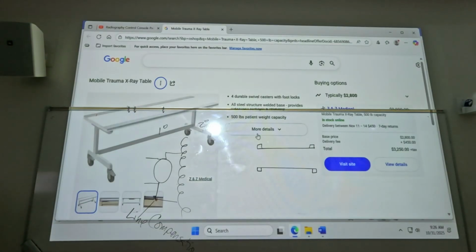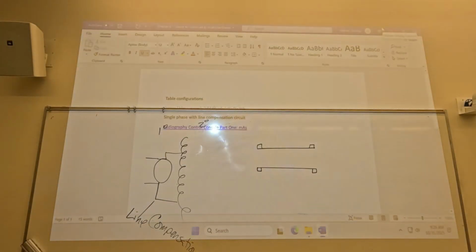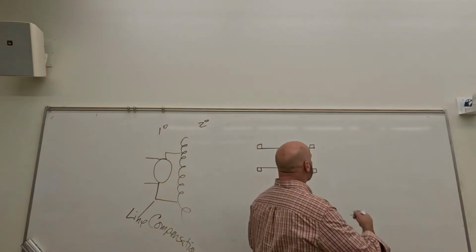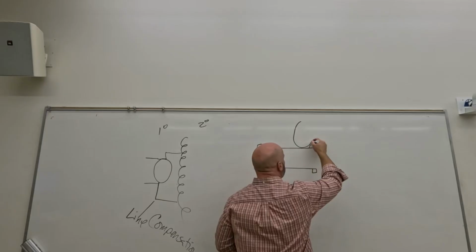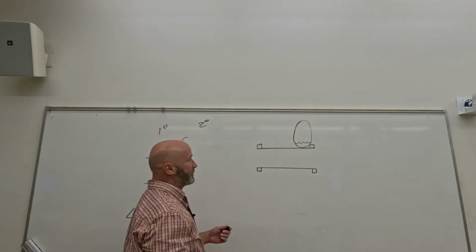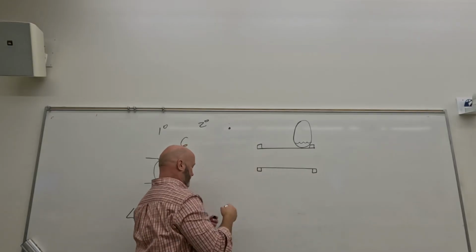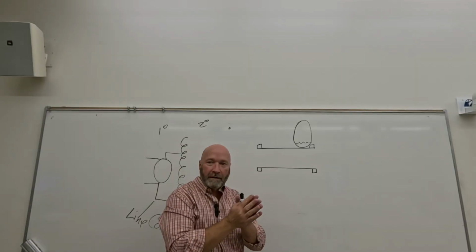Kill that. Let me turn this off. And the answer is potentially, yeah. If you're doing, let's say, a decubitus chest x-ray on a patient, and we've got a pleural effusion, a lot of fluid in this guy's lungs, so you put your x-ray tube on the far side, and the beam comes from a point spot and it spreads out.